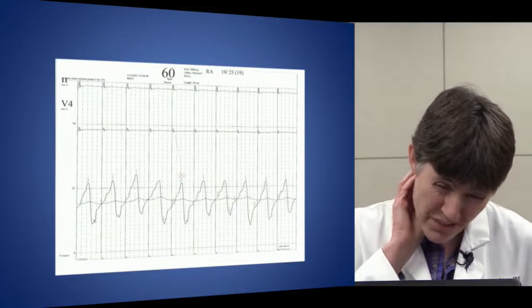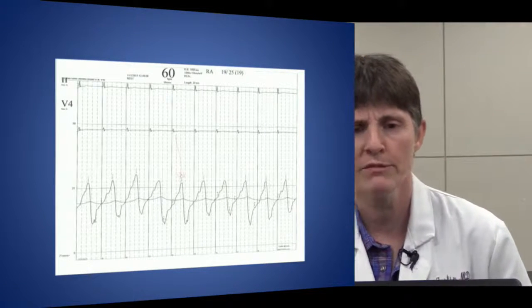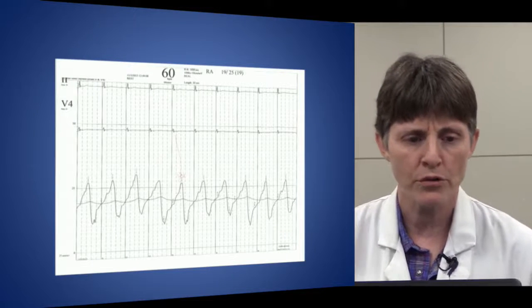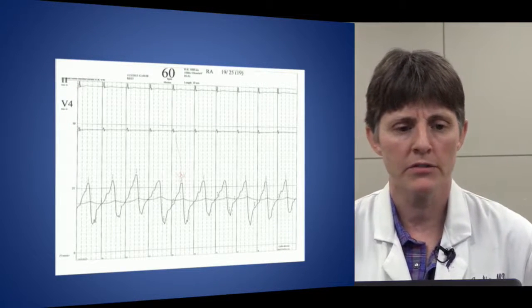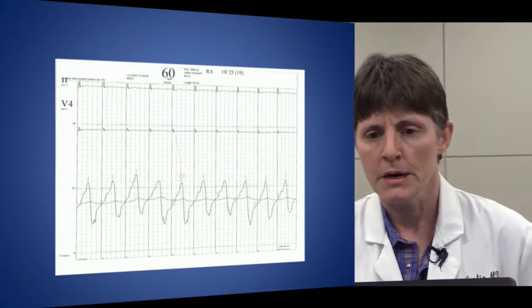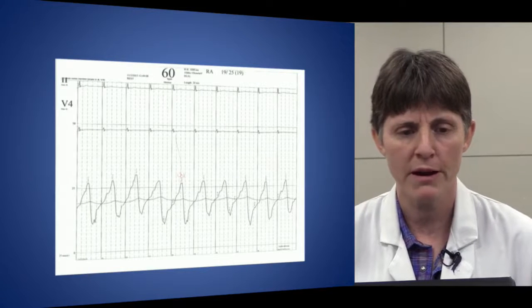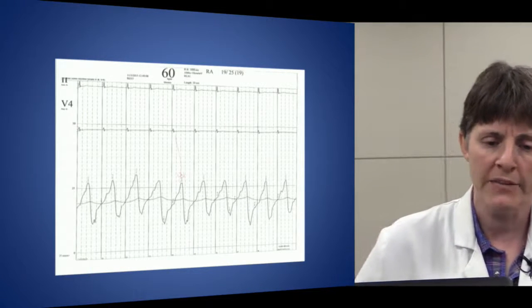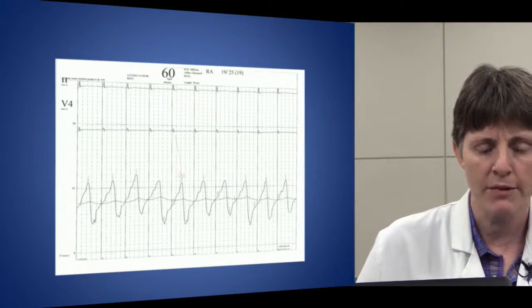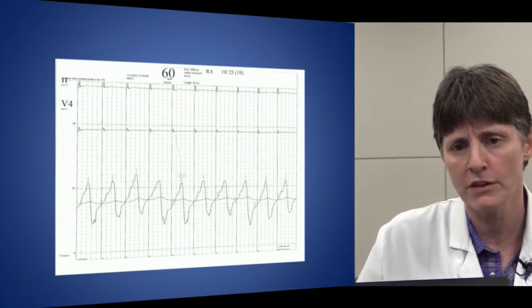This is a RA tracing that doesn't look exactly like a right atrial tracing, but again, the point of this is to show you that pressures are very different. So on this tracing, pressure is 0 to 50. There's EKGs at the top, time goes along the bottom, and for every EKG spike, we see that there's a waveform. In this case, there's a big CV wave. The right atrial pressure is high. It's about 20 and not the 5 that it ought to be.